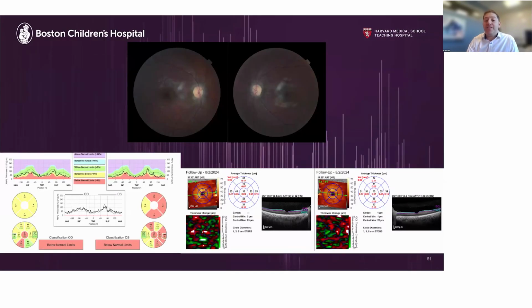We ended up treating her again with Diamox, and this is what her nerves actually should look like. And again, they're back in the 60s. Fortunately, she had no increase in the level of optic atrophy that she had, and has had no effect on her visual function. But here's another example of you don't trust the colors, and sometimes you can't even trust the numbers. You have to go with what the trend is.